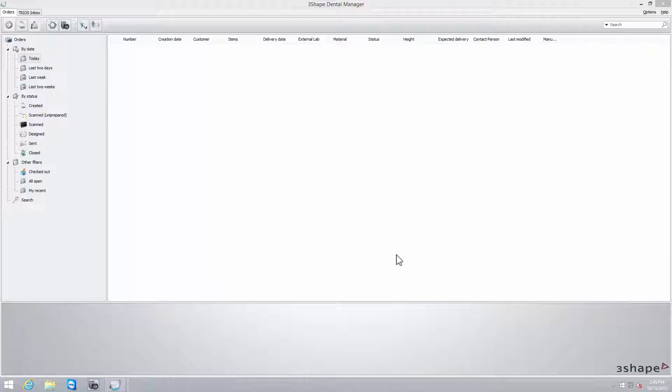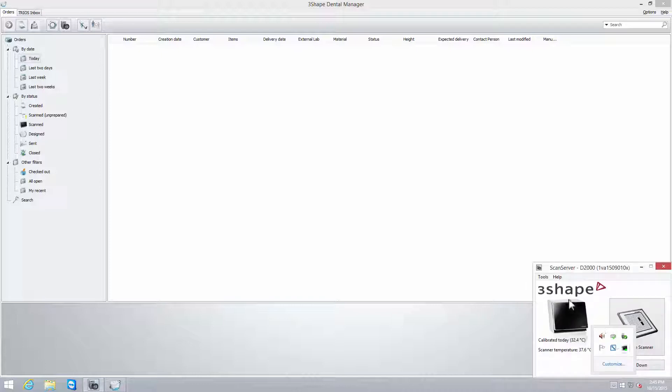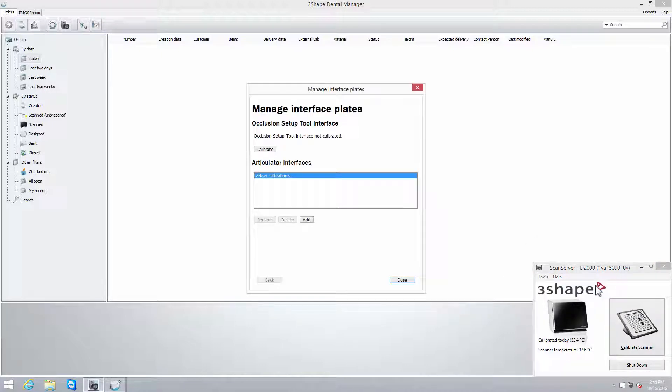Before use, the Occlusion Setup Tool and its interface plates need to be calibrated. To do that, open ScanSuite by clicking on the ScanSuite icon in the system tray. Select Tools to open the Manage Interface Plates dialog window, then click Calibrate.